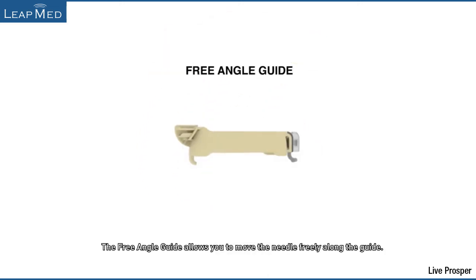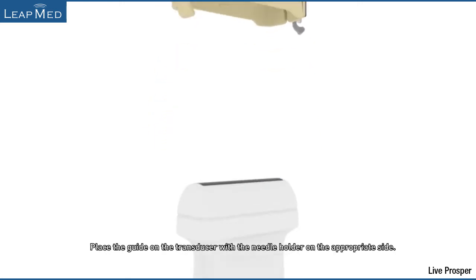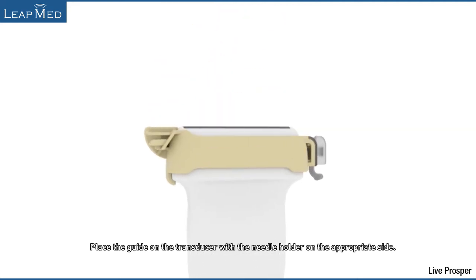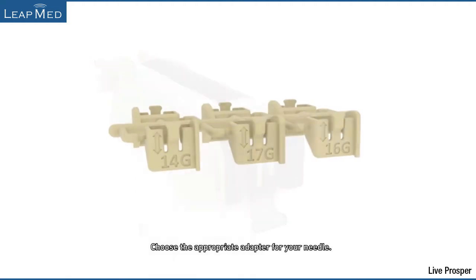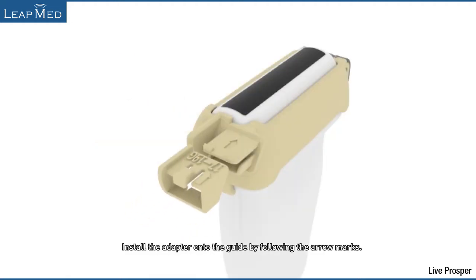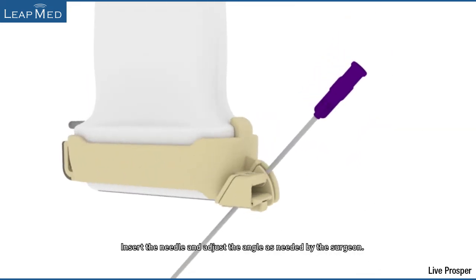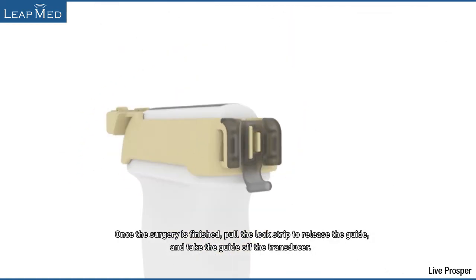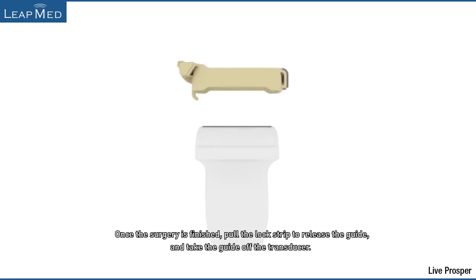The free angle guide allows you to move the needle freely along the guide. Place the guide on the transducer with the needle holder on the appropriate side. Put the lock in place to stabilize the guide. Choose the appropriate adapter for your needle and install the adapter onto the guide by following the arrow marks. Insert the needle and adjust the angle as needed by the surgeon. Once the surgery is finished, pull the lock strip to release the guide and take the guide off the transducer.